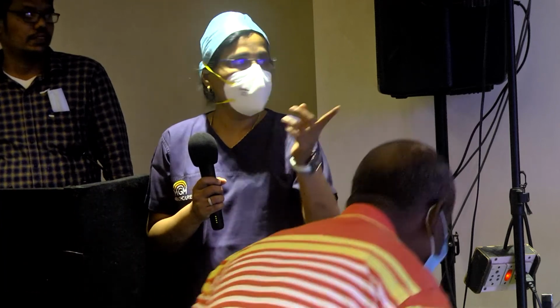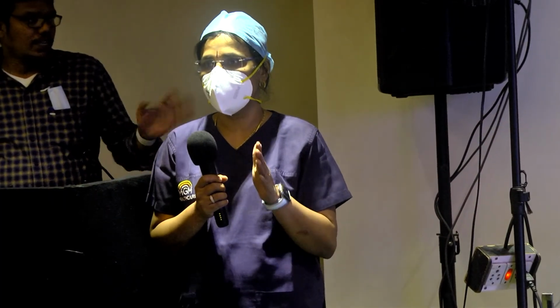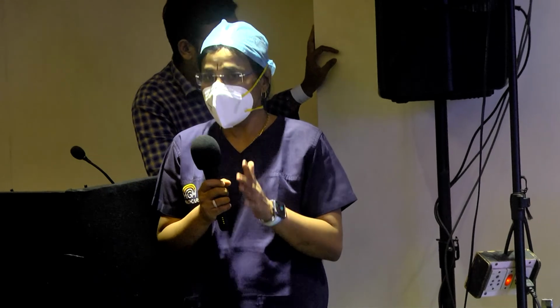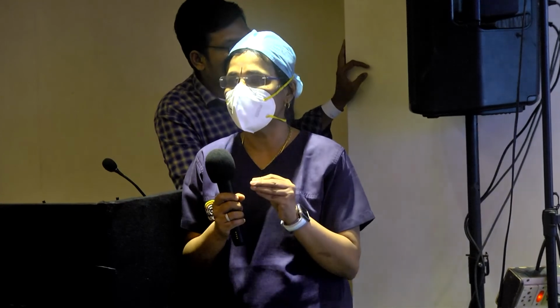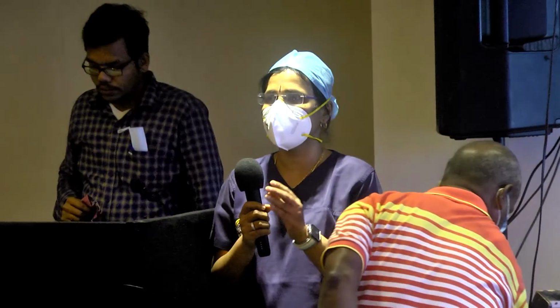Then it is also described, like how we showed in one of our patients, ECMO and IABP. The IABP helps to unload the LV to some extent, and it helps to prevent distension. Now, of late, the newer Cath lab minimally invasive technique is putting an Impella on these patients. So Impella also acts something like an IABP, and it also helps to reduce the afterload of the patient.